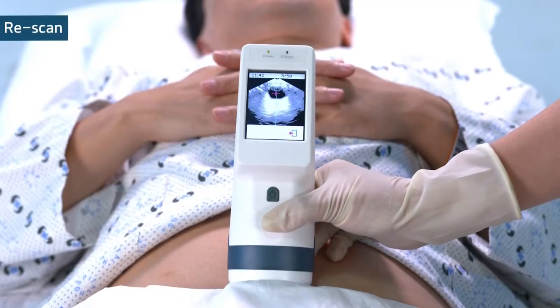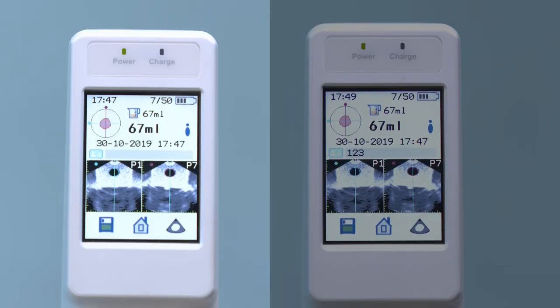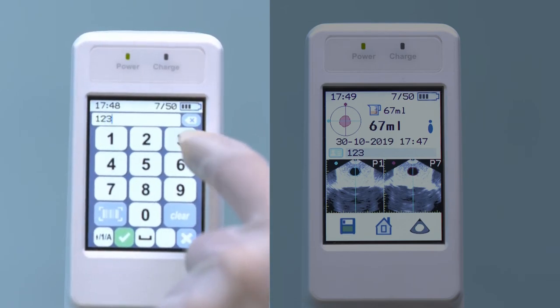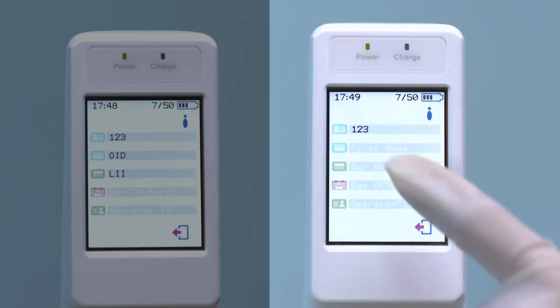If you need to rescan, simply press the scan button again. Patient information can be saved by virtual keyboard or barcode reader. Tap the blank of the patient ID on the scan result screen and enter the data by virtual keyboard, or simply scan the barcode to enter the data.